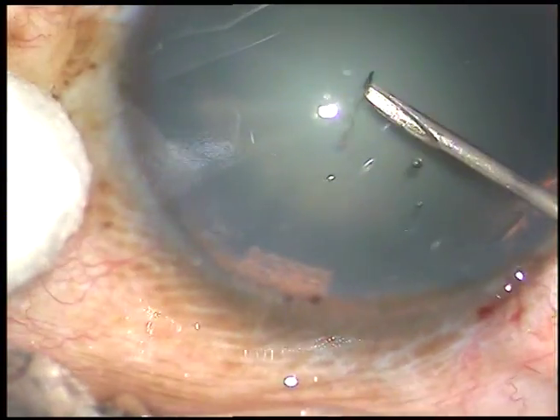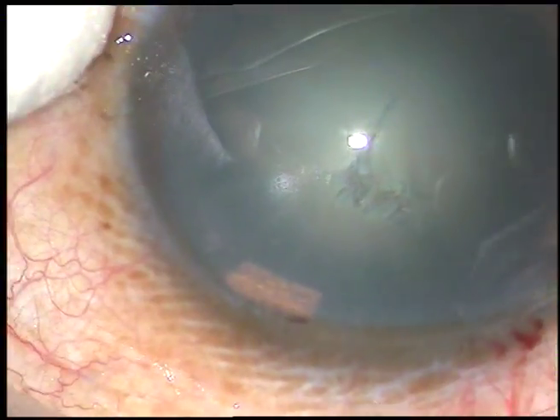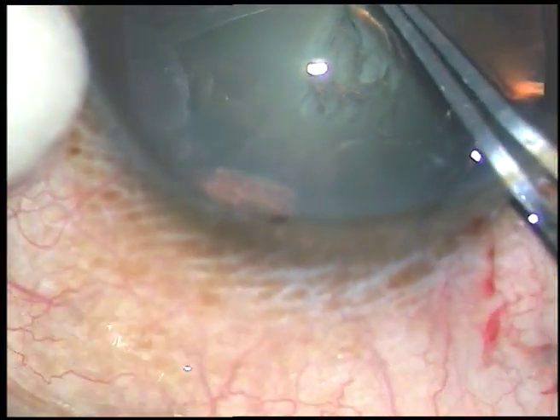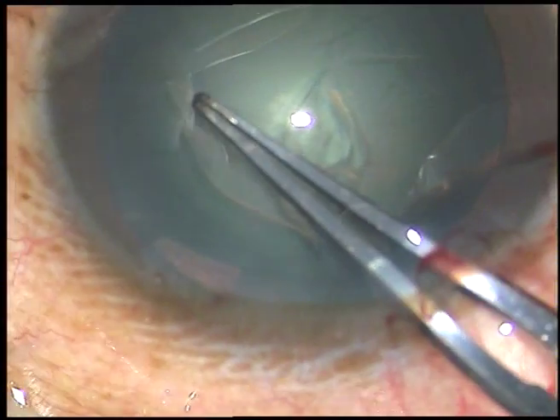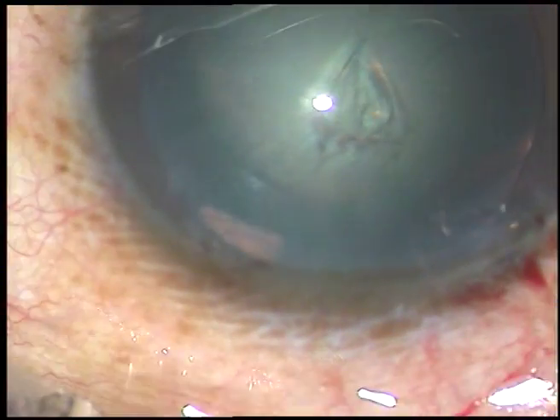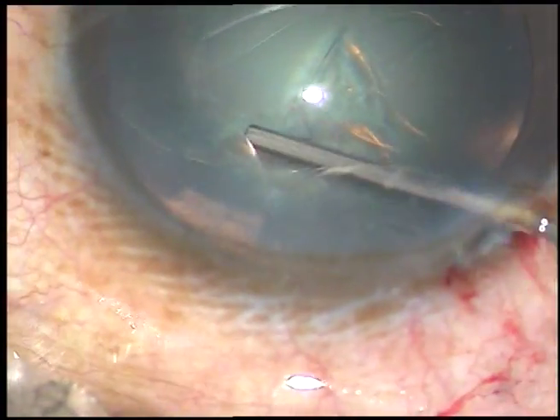Capsulorhexis is done. The capsule is incised with a 26-gauge bent needle. The capsular tag is held with Utrata forceps. With anticlockwise movements the rhexis is completed. This has been a rhexis of adequate size.